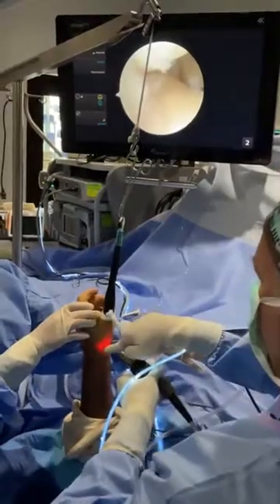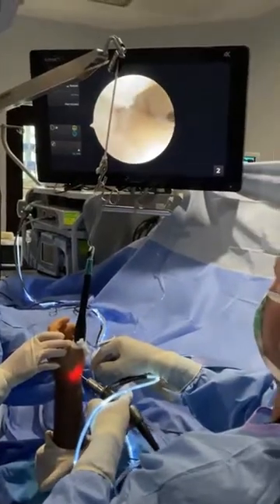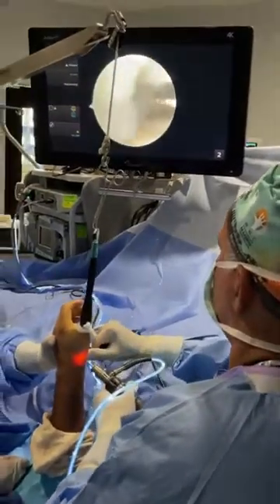Right there is the dorsal radial ligament, and that looks kind of ratty. So we're going to change portals in a moment and then we can do the shrinkage.